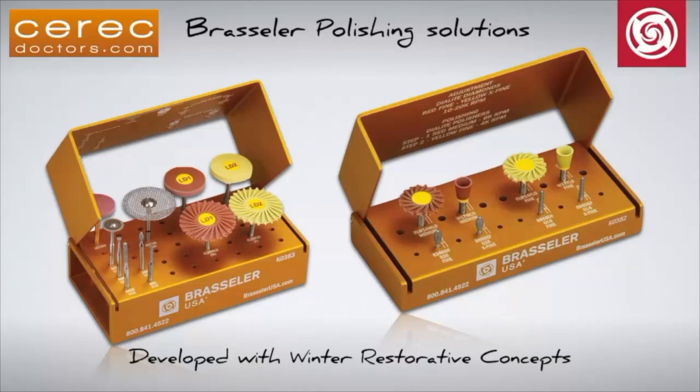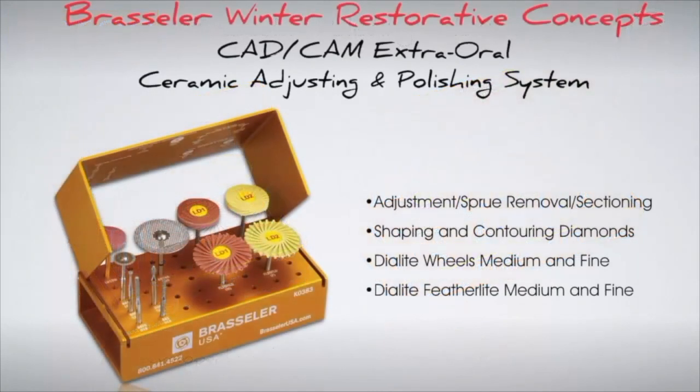These kits were developed specifically to ensure maximum clinical success using a sequential polishing technique. The extraoral CAD-CAM adjustment and polishing system was developed to create an efficient and safe way to adjust, contour, and polish both glass ceramics and zirconia restorations. It includes both the Dialite wheels and Featherlight polishers in medium and fine grits to achieve the most natural polish.